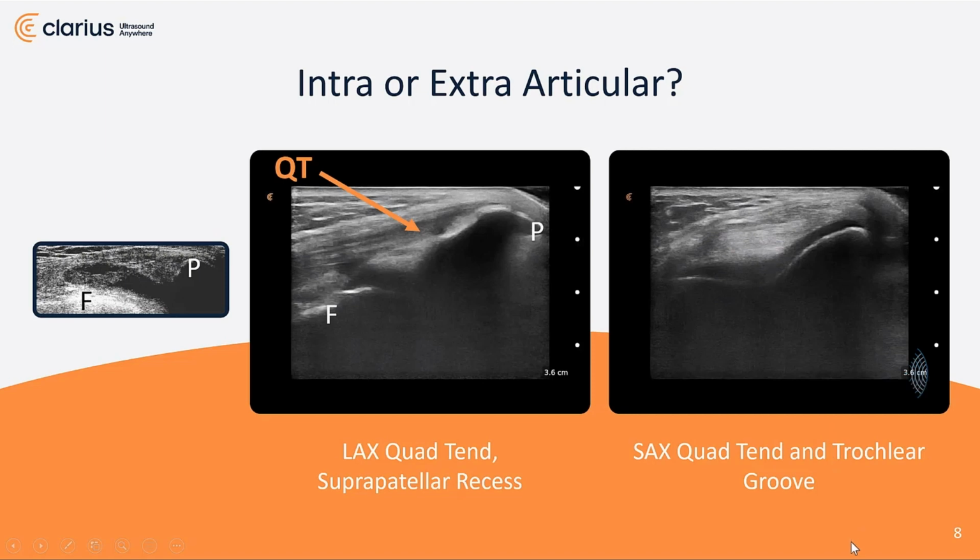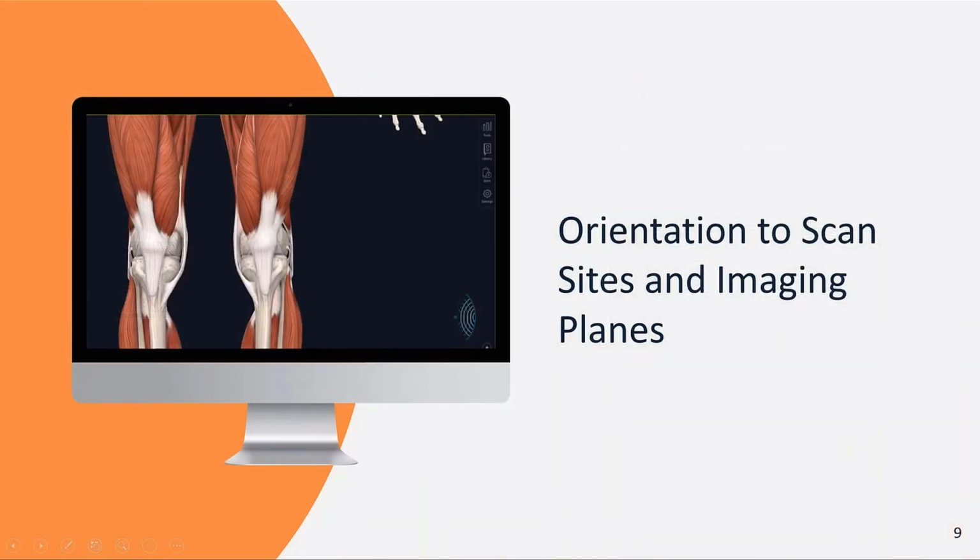I showed you this because the patient in the case study demonstrated no intra-articular effusion, nothing that would make us think ACL, meniscus, osteochondral defect, or anything else that may be helpful in identifying what is the actual working diagnosis here. And so now, after clearing the internal articular region for pathology, we're going to move on to take a look at the structures on the lateral aspect of the left knee.